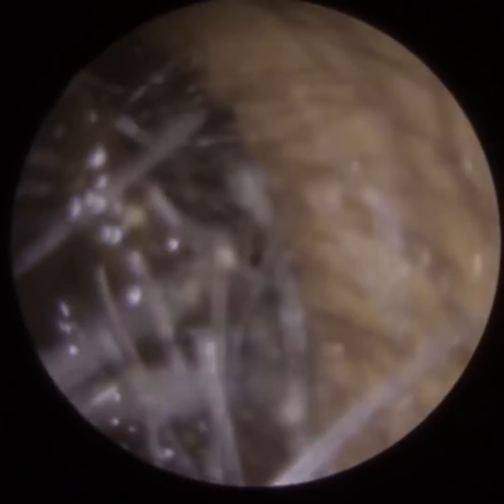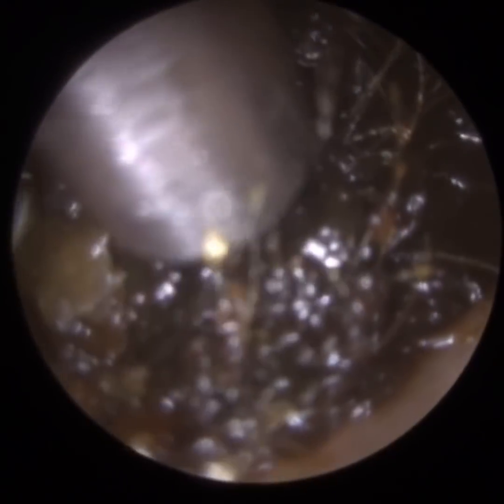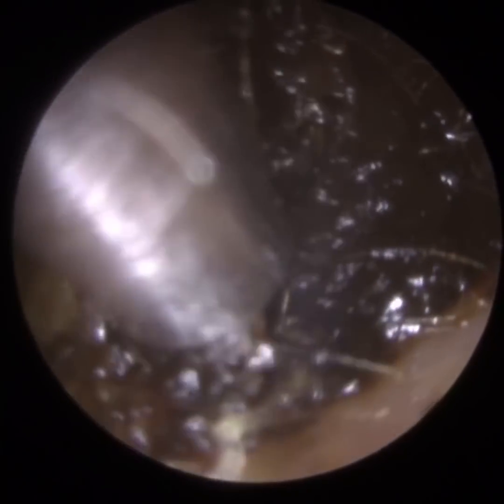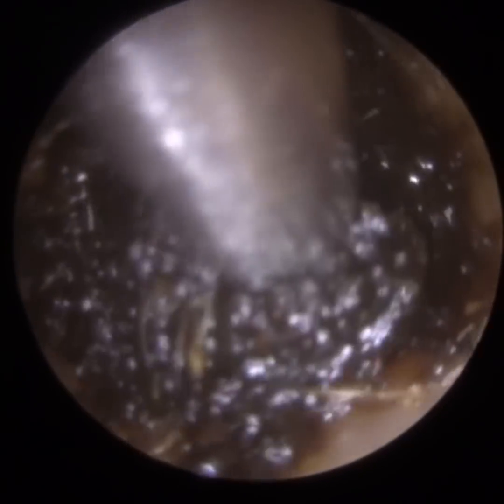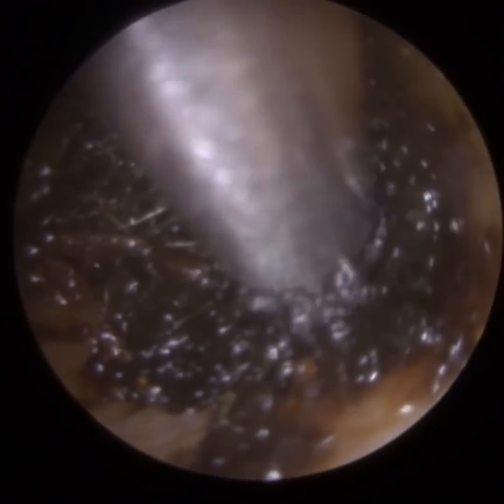It means the earwax has typically been in there for a long, long time — it's oxidised. If you think about an apple or avocado, as you cut into it, because the flesh becomes exposed to oxygen, it oxidises and can slowly turn black. Hence why quite often if you're preparing apples or an avocado, you'd put it in a bowl of water with some acid, some lemon juice for example, to stop the oxidisation process.